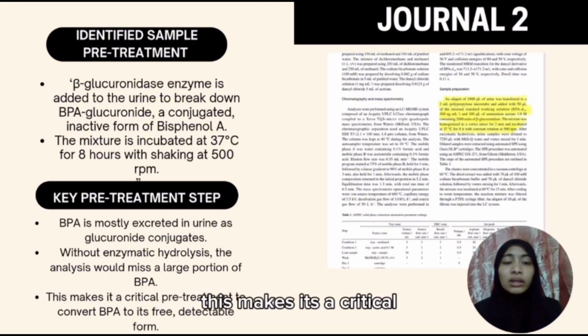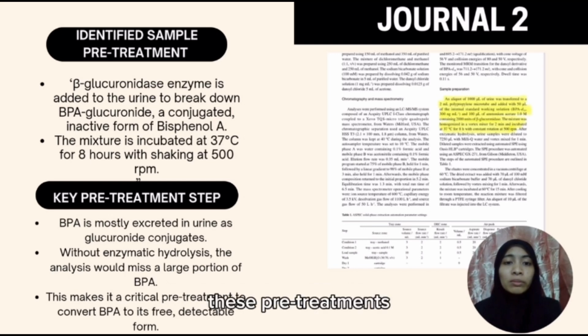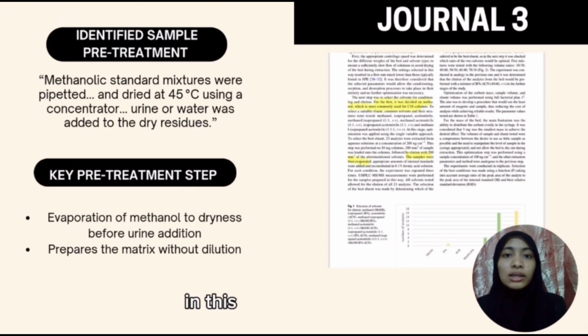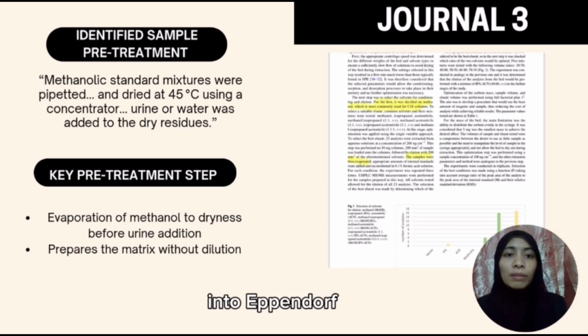This makes it a critical pretreatment to convert BPA to its free detectable form. This pretreatment step ensures that the measurement reflects total BPA exposure. In the last journal, in this case, the researcher first added a methanolic solution of drug standard into Eppendorf tubes.